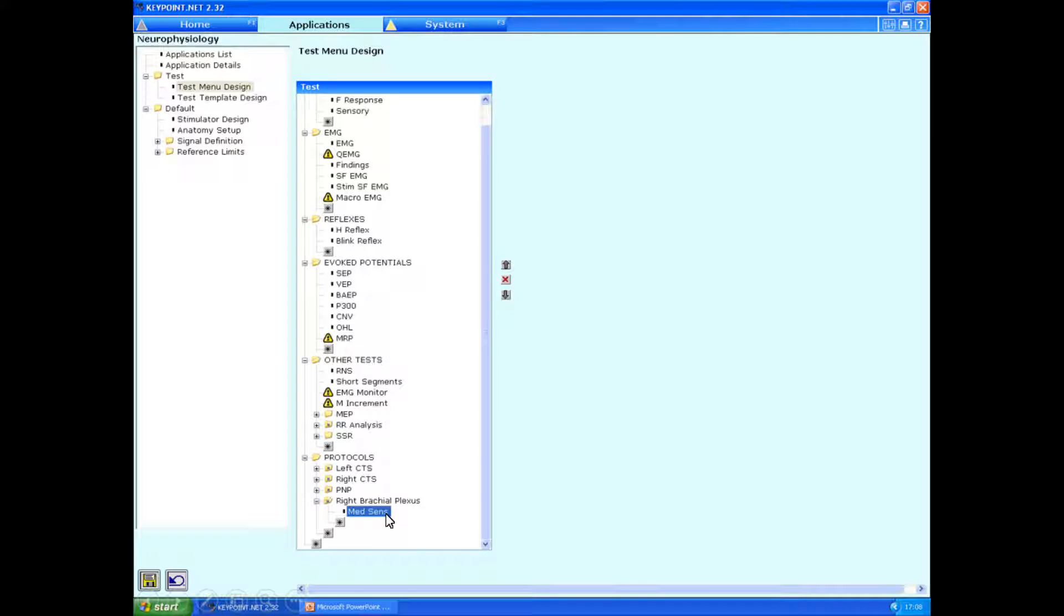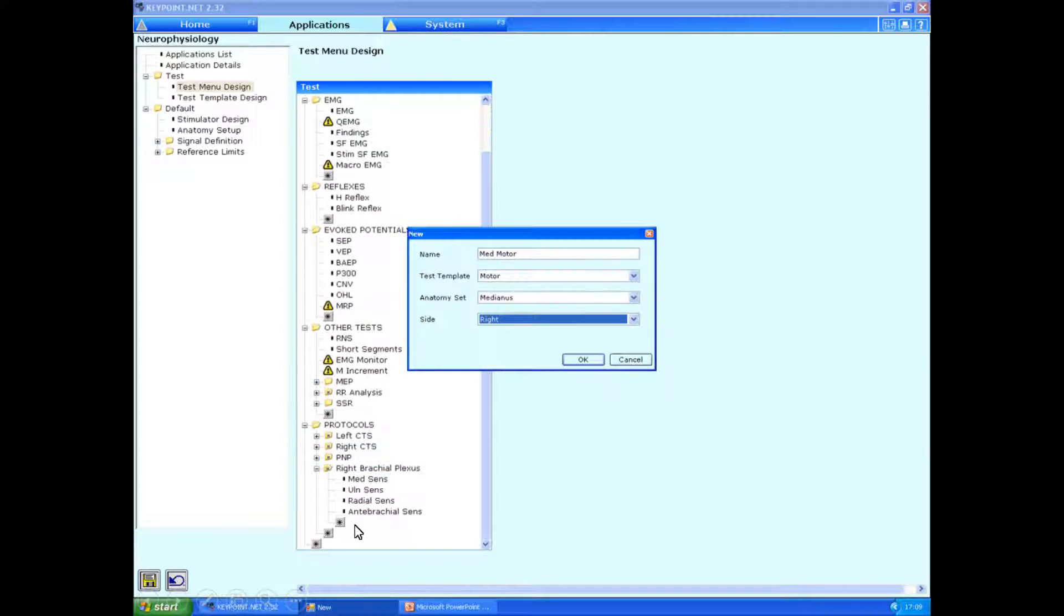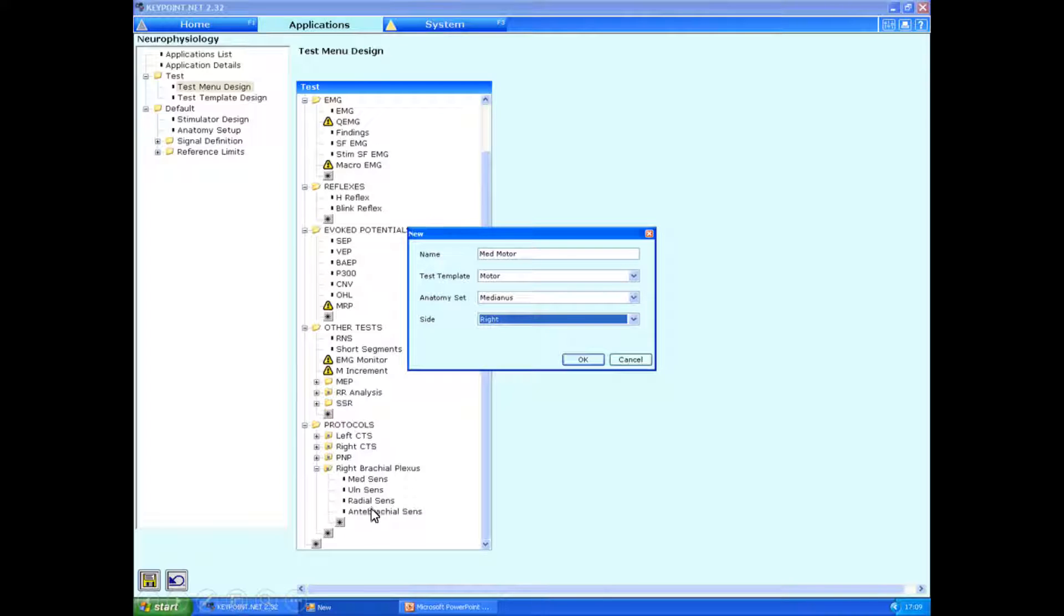This now appears in the selection of the protocols. We can then add, for example, the ulnar sensory nerve, radial sensory nerve, antibrachial sensory nerves, in exactly the same way.